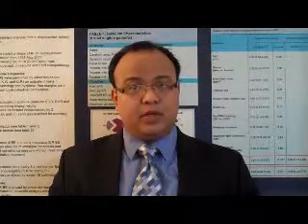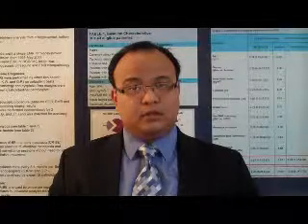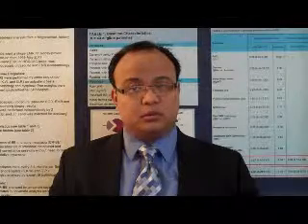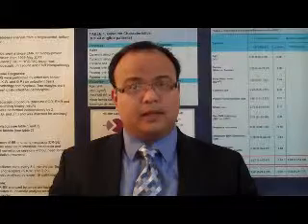To begin with, this is the first study to demonstrate the feasibility of using a topical fluorescent glucose analog called 2-NBDG in endoscopic mucosal resection tissue to detect dysplasia. Second, this study presents a new endomicroscopy criteria based on fluorescence intensity from 2-NBDG uptake in dysplastic esophageal mucosa.